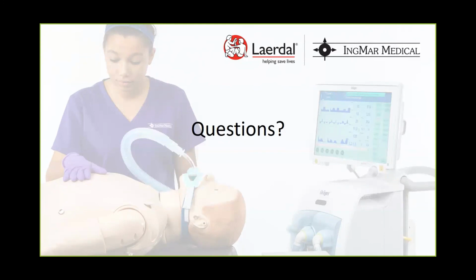Our next question is for Joe. Joe, I think we talked about this a bit, but maybe you can give us some more detail. Is installation required? Yes. Although the lung adapter installation is fairly simple and straightforward, assuring proper setup and software configuration is critical. So in order to protect the warranty of your simulator, installation is required.